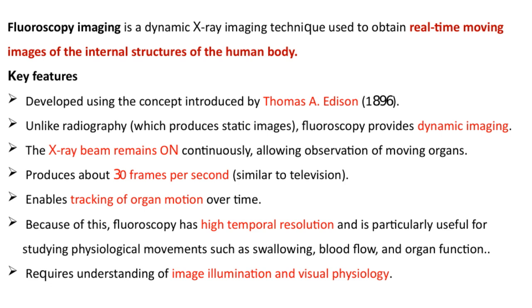However, to interpret these images effectively, it's important to understand how image illumination works and how our visual system perceives these moving images. Overall, fluoroscopy is a powerful tool that combines technology and physiology to help us better understand the body's complex movements in real time.